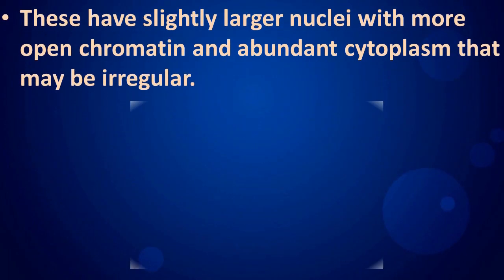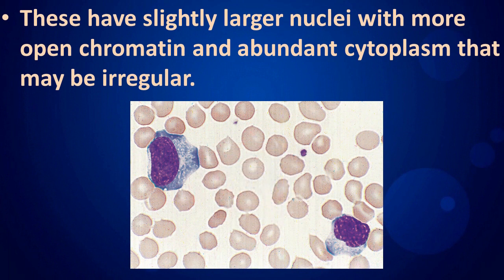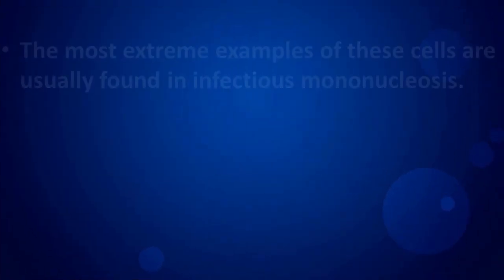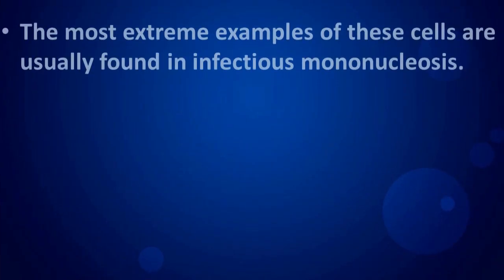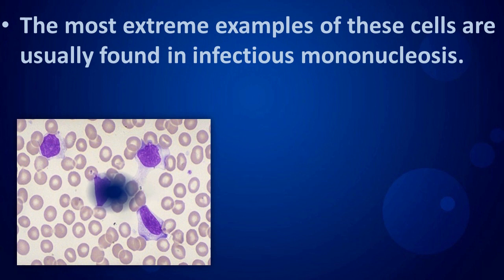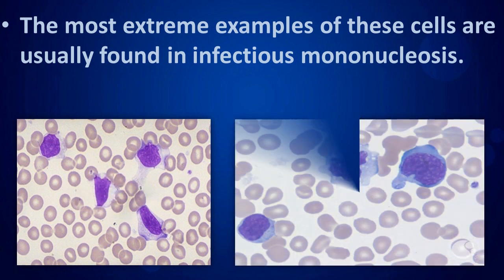These reactive lymphocytes have slightly larger nuclei with more open chromatin and abundant cytoplasm that may be irregular. The most extreme examples of these cells are usually found in infectious mononucleosis.